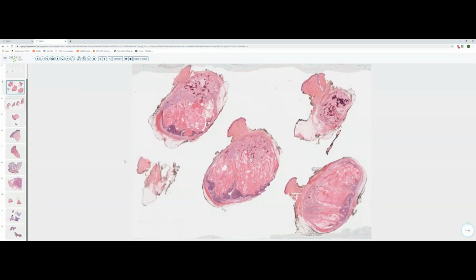We'll go ahead and move on to slide 3. Both slide 2 and slide 3 underscore the fact that occasionally tinctorial or staining patterns, or the appearance of the color in sections, can be a real clue to a given diagnosis.